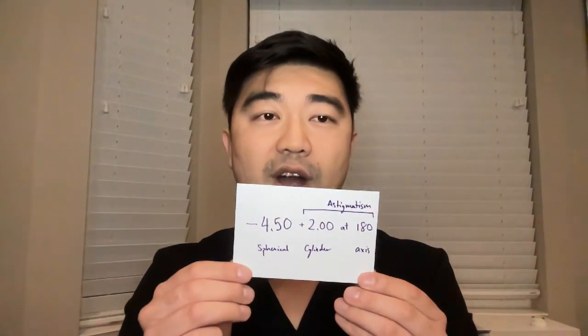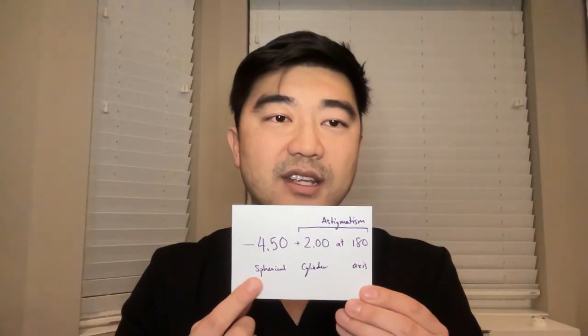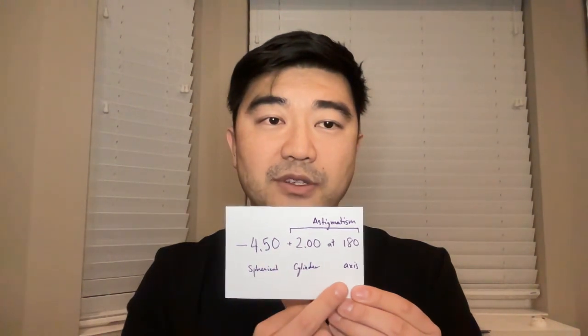In this video, we will go over what to expect with a basic monofocal intraocular lens. The first thing to know is that this lens can correct for approximately half of the equation of a prescription. That is, the first number in what is commonly three numbers in a prescription for corrective lenses written by your eye doctor. In an example, this is the number that it will correct for, but not these two numbers.